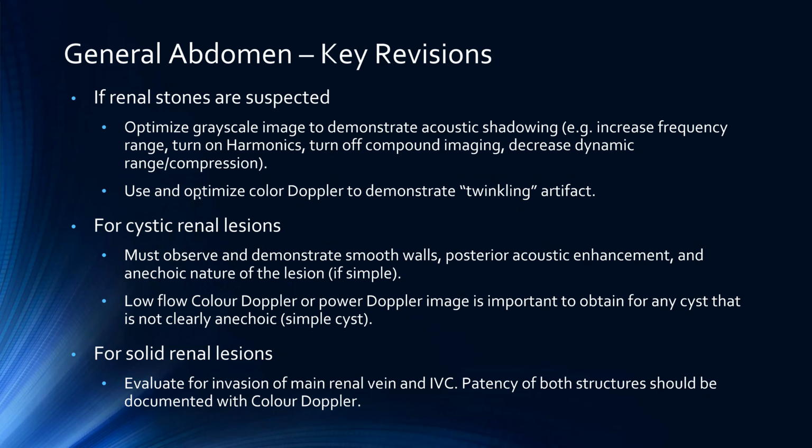Aside from that, it's useful to throw on color Doppler if you do see something that looks like a stone, just to demonstrate associated twinkling artifact, as it is a little bit more sensitive and specific than our grayscale findings.